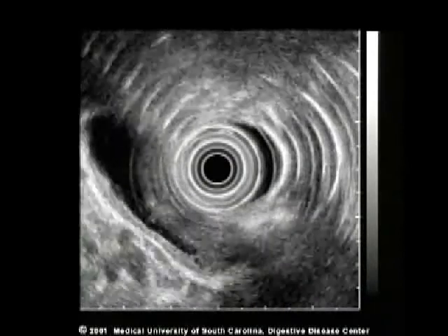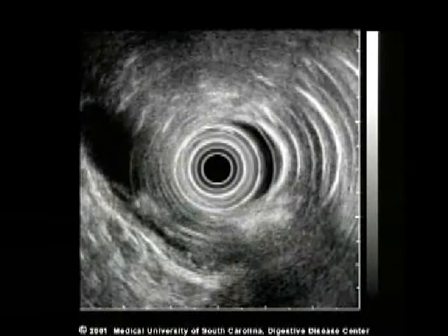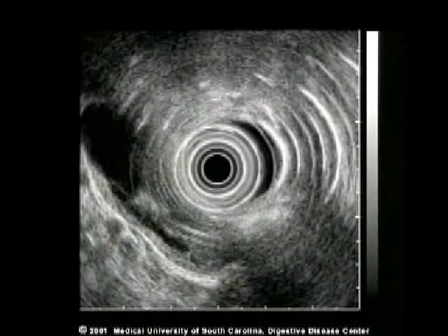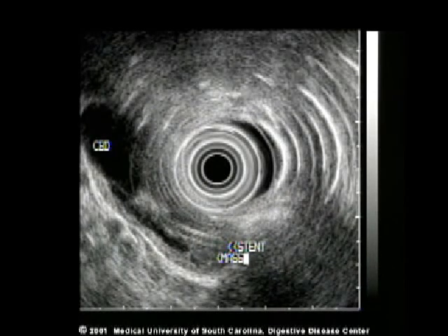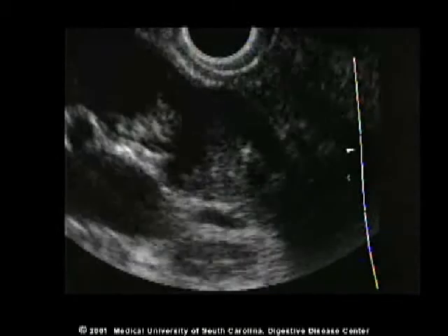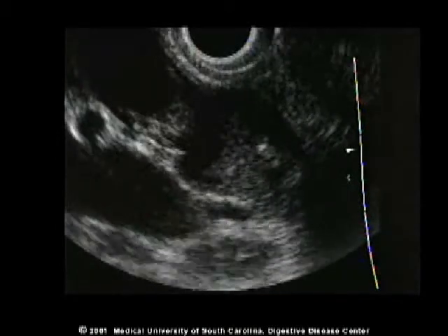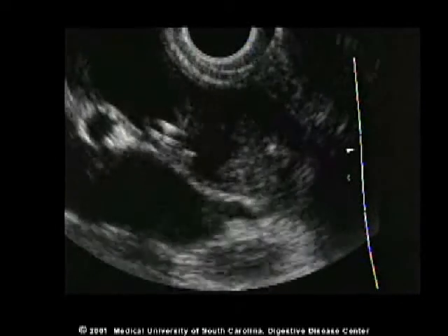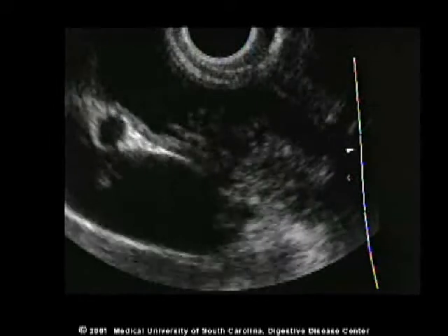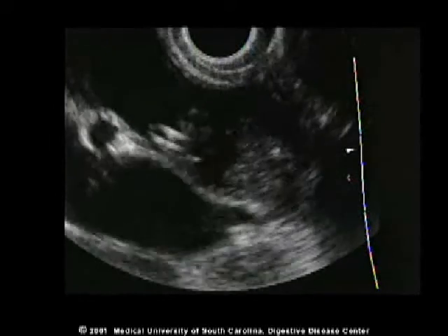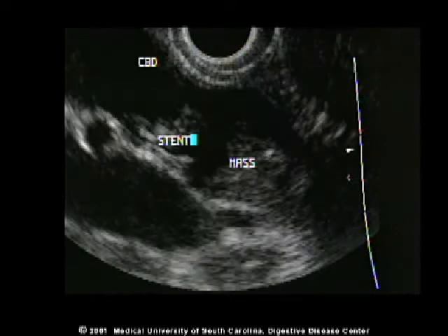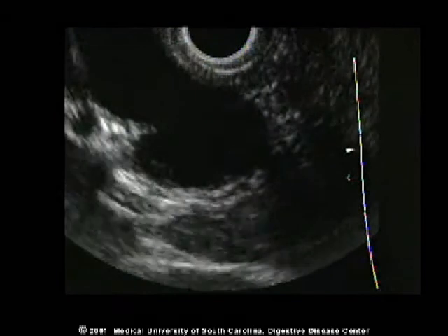Another common bile duct mass is shown here. The transducer has been placed in the duodenal bulb with the common bile duct imaged. A mass is seen in the common bile duct with a stent coursing through the center. Focusing on the lower half of the screen shows the mass appears to extend through the wall and very close, but not into the portal vein.